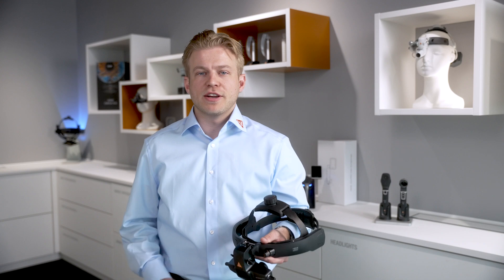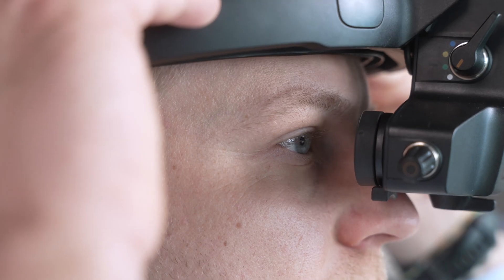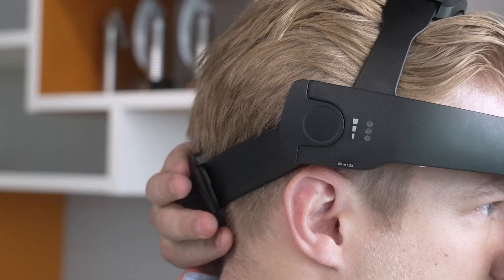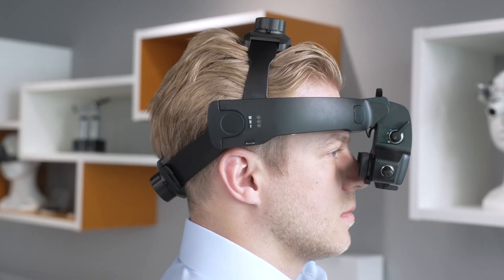Now let's place the BIO on our head. Adjust the top knob so the front pad rests just above your eyebrows, and adjust the back knob until the fit feels snug. If the unit feels front heavy, make sure the back pad sits just under the occipital bone, and this will help balance the weight.